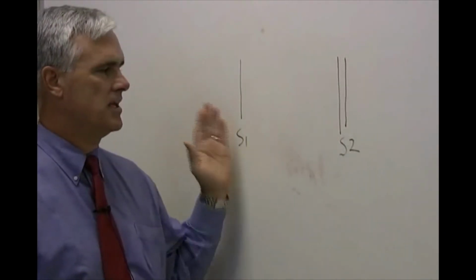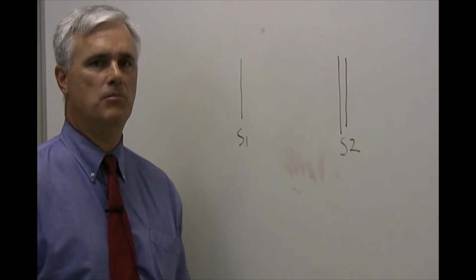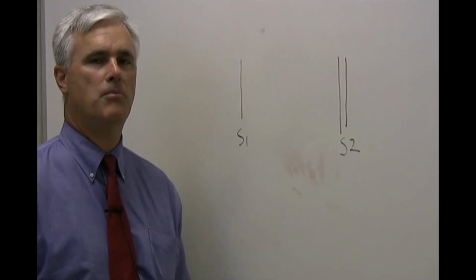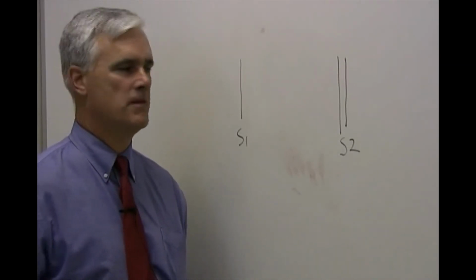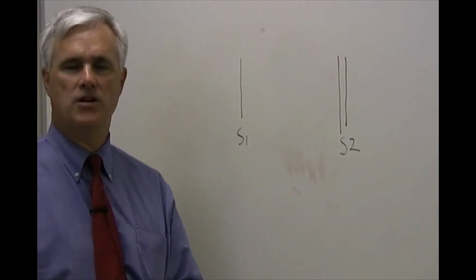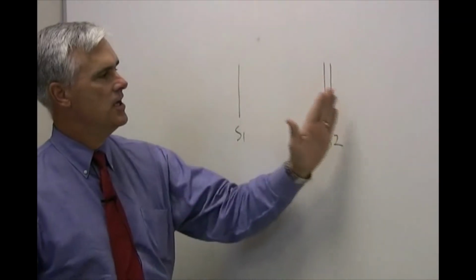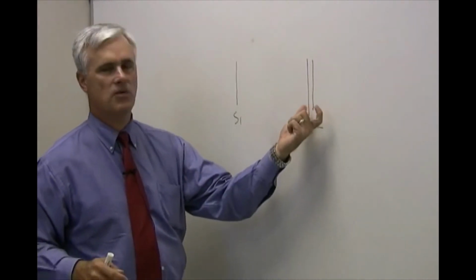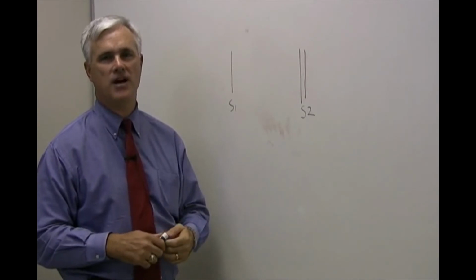So it goes something like this. Bump, bump, bump, blum, bump, blum, bump, blum. So when you're listening to Harvey, try to make sure you can hear the splitting. Occasionally, you will hear the splitting to be really wide if you have something like a bundle branch block or you have a left or right shunt.